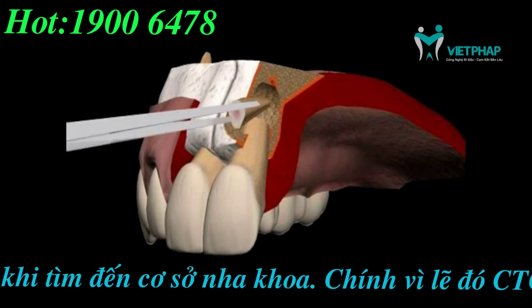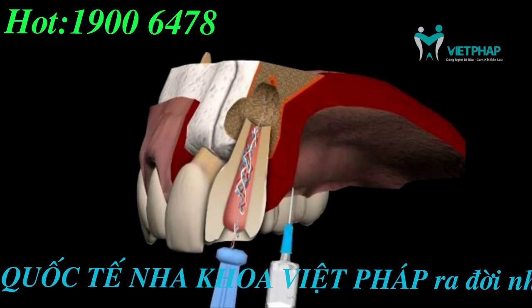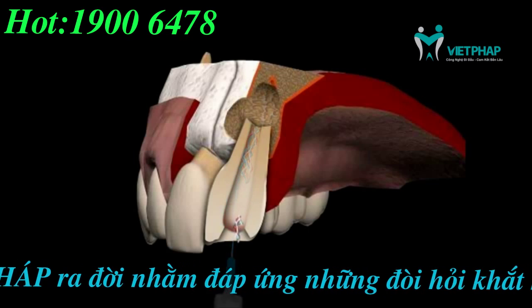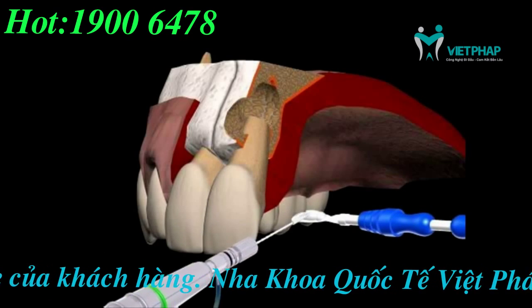Next, you see another instrumental root canal cleaning. The area is repeatedly flushed with special solutions in order to remove tooth particles and tissue residue that were cut off during the grinding process. Lastly, the canal is dried with a paper tip, and the clean canal is filled with sealing cement again.